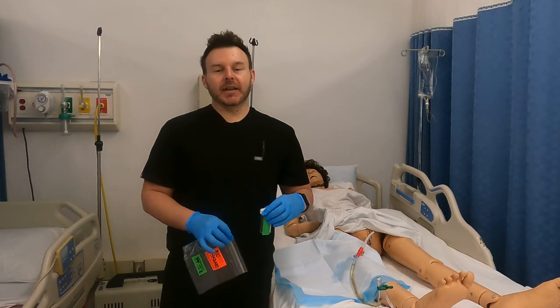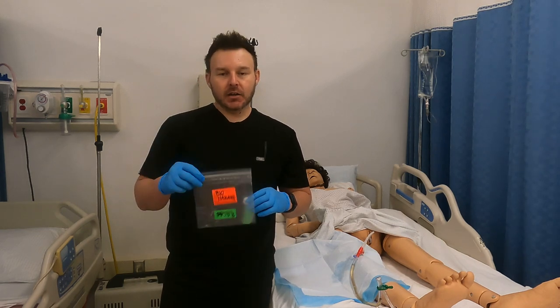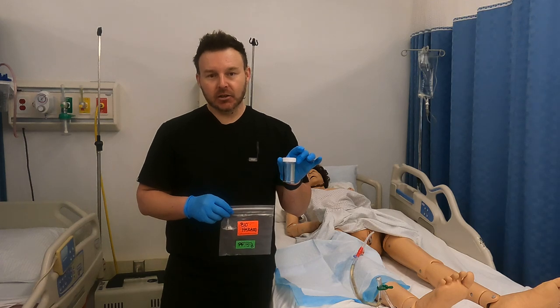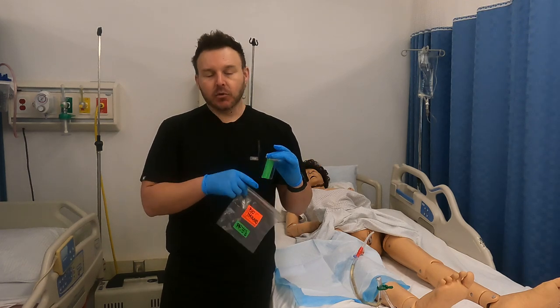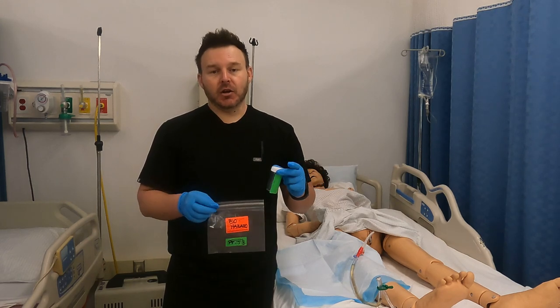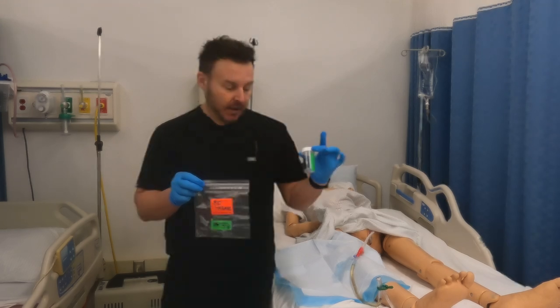I've determined that enough urine has collected in the tubing. I've gone ahead and got my red biohazard lab bag as well as a collection container for the urinary sample, labeled with my patient's sticker — their name, date of birth, or whatever policy your hospital has to keep that identified. I have that right with me.